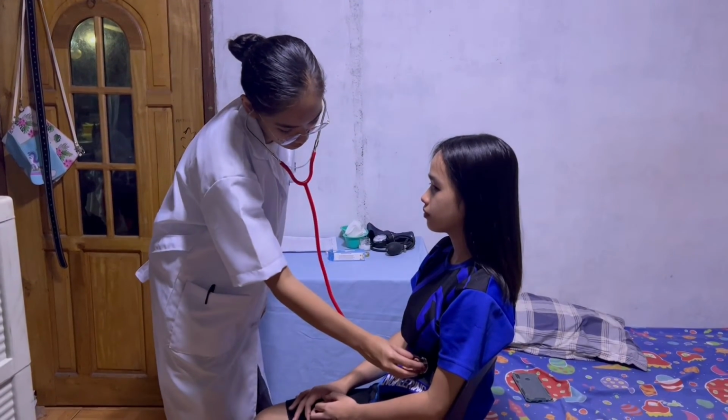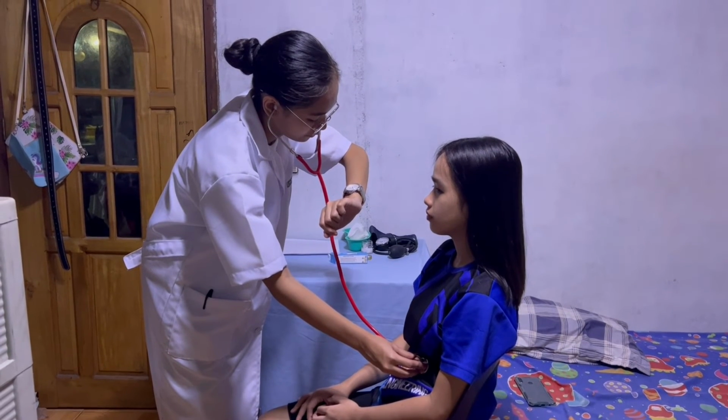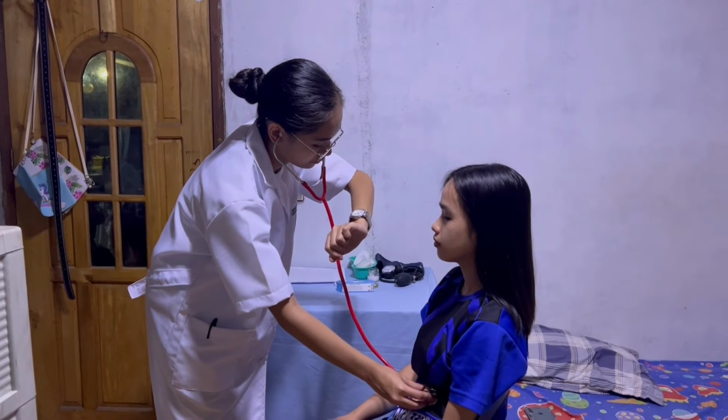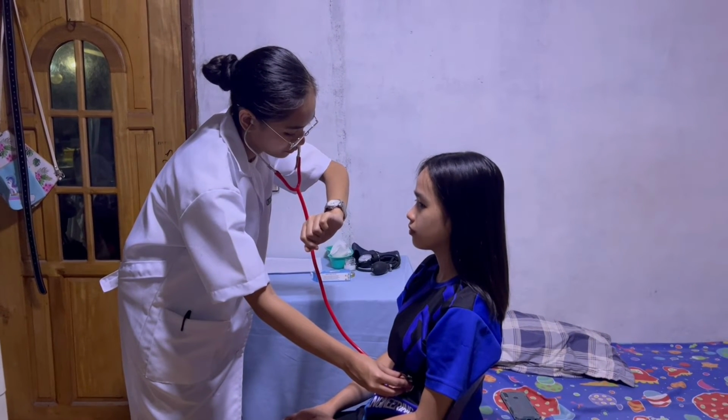Place the diaphragm of the stethoscope over the apical impulse and listen to the normal S1 and S2 heart sounds, which are heard as lub-dub. Count the apical pulse for 1 full minute. Assess the rhythm and the strength of the heartbeat.